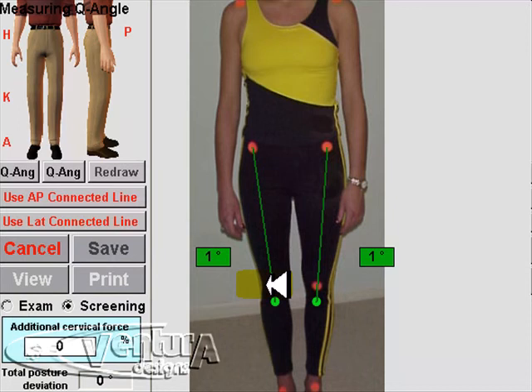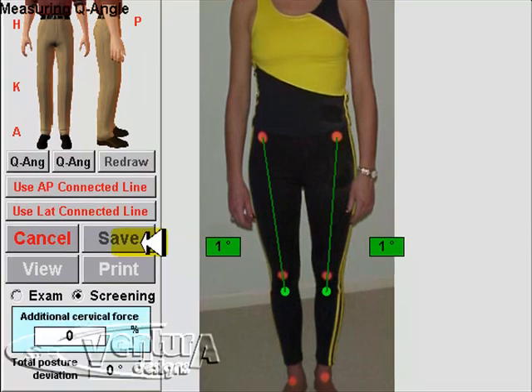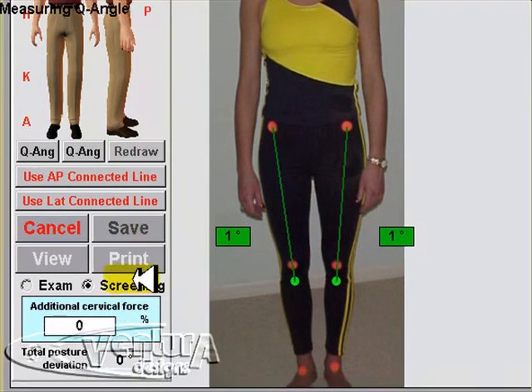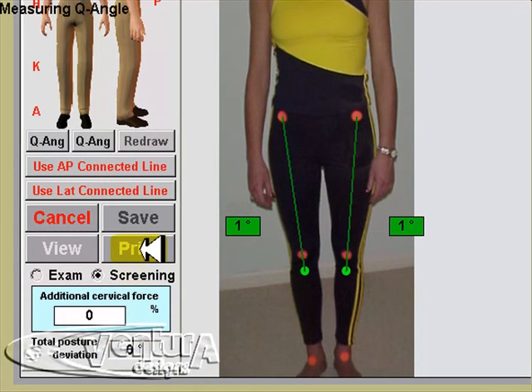After the Q-angle is measured, you can save the exam just as a regular posture exam. You can also print a quick report by clicking on the print button.